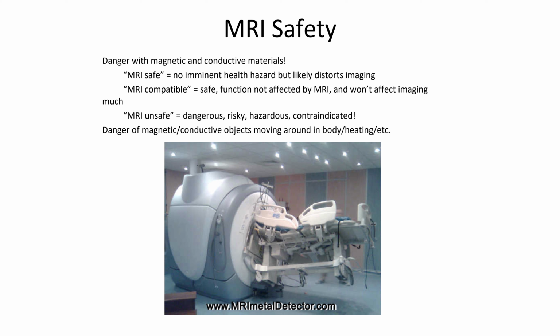So also, MRI safety comes into play with implants inside patients. So we try to classify these. Not only can you get magnetic parts like metals and things moving around in the body, but they can also heat up. Whenever you have a magnetic field, you push electrons, you push electricity through that metal, which can heat it up. And so you have to worry about internal burns as well.